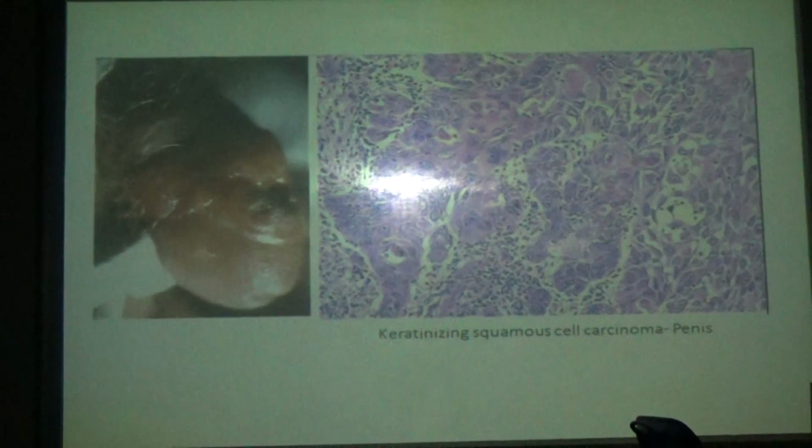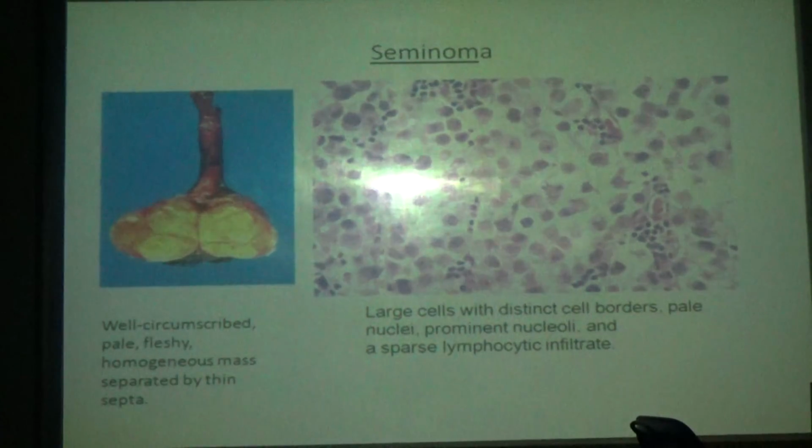Shall I go for the next slide? Okay. Next we will go for the tumors. Many testicular tumors have been completed, right? Okay. Can you tell me some tumors apart from seminoma? Stromal cord. Sex cord stromal tumor.